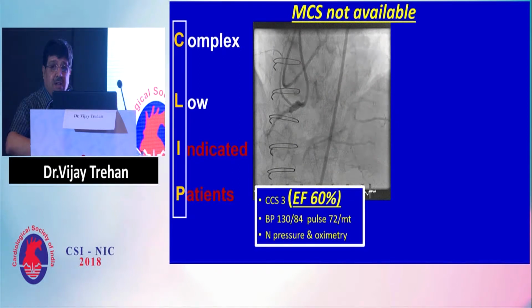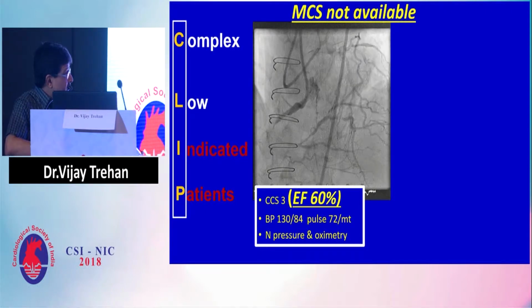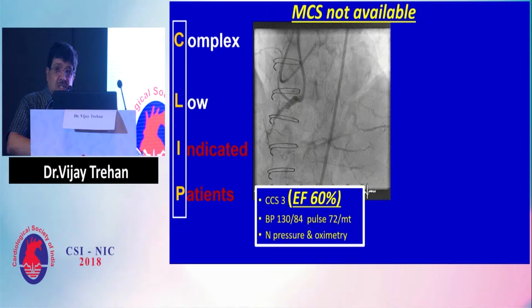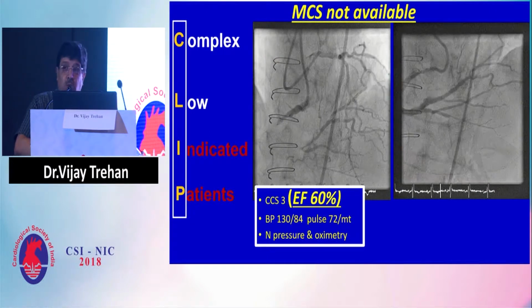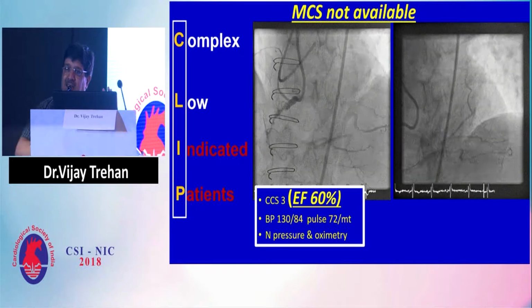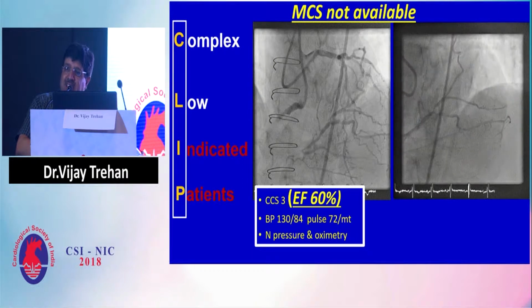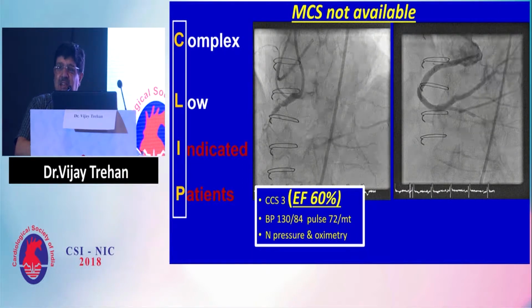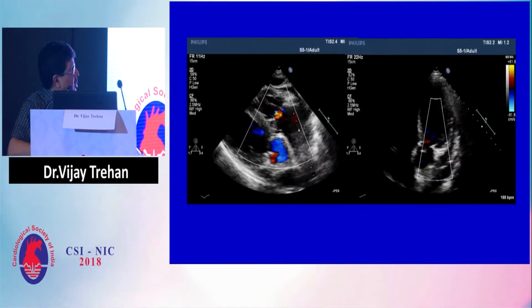It means you start your practice in patients who have a good left ventricle, good hemodynamics, good PAs, and then become proficient so that you're able to handle these complex cases and get good results. And gradually you can develop your skills so that you can start these complex cases in not a very good environment, in low ejection fractions and compromised hemodynamics.